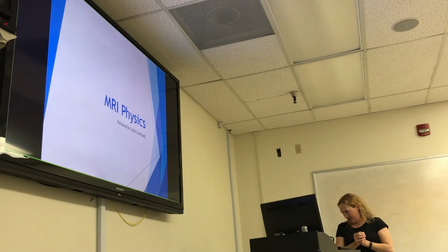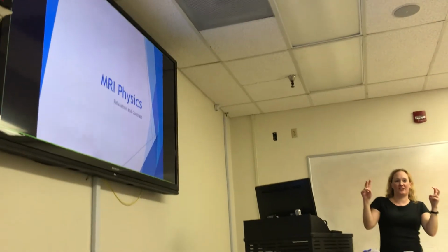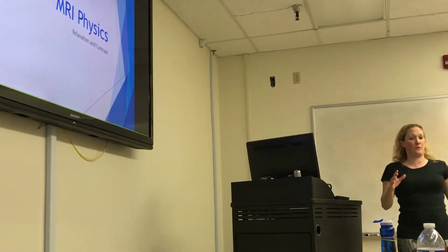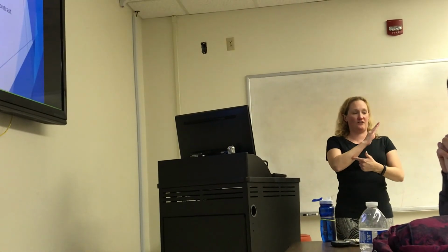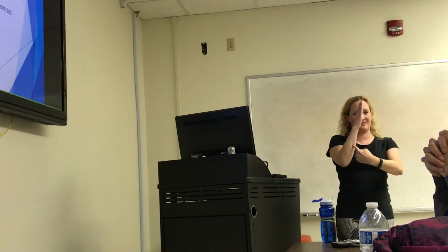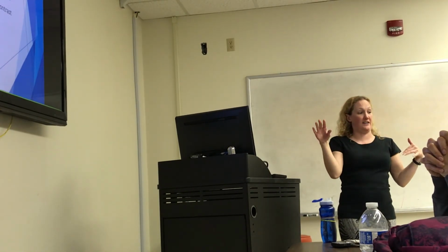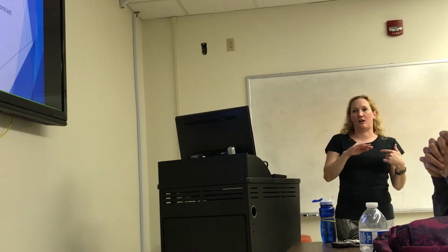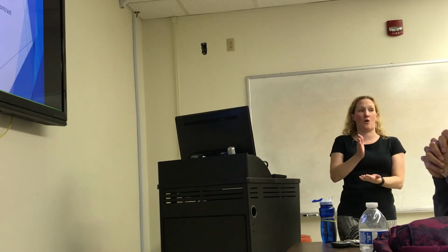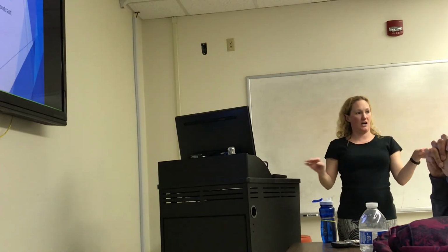And then what function does it provide? I wouldn't say it's really functional, but it just so happens that when we talk about gradients next week, the center actually serves as a fulcrum. It's like a seesaw, okay? So the center is the center of the seesaw. It's the fulcrum because it doesn't change. The rest of the magnet we're going to find out is actually going to change, but our center, our isocenter, is always going to stay the same, and it's that seesaw fulcrum. But we'll talk about that next week.